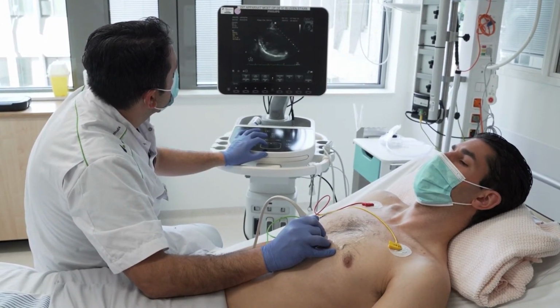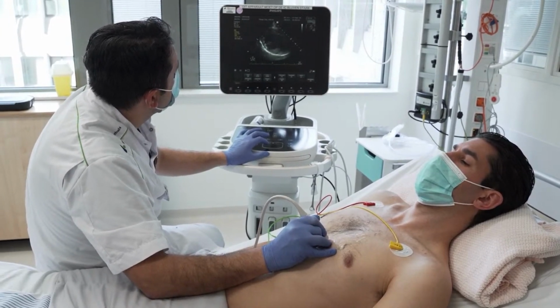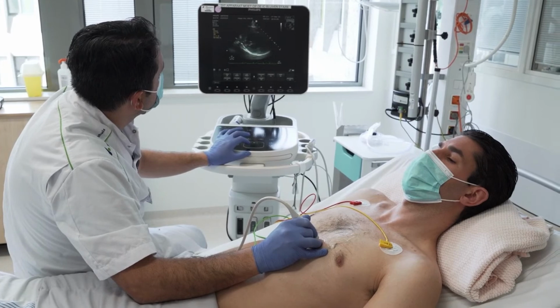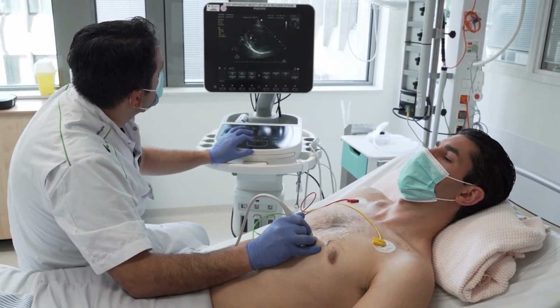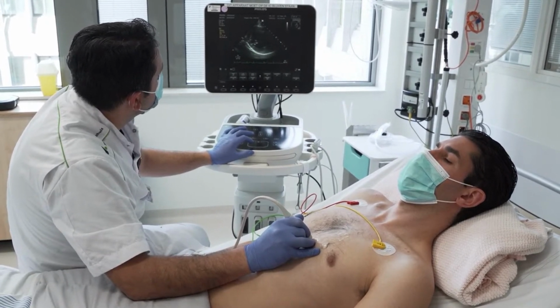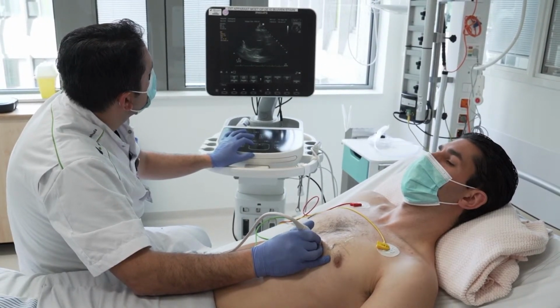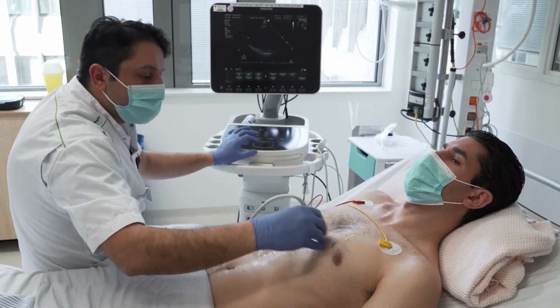Now we have a very beautiful short axis view with the mitral valve. As you can probably see, Sakir has gone down one or two parasternal spaces. So you really have to search for the best parasternal window. There can be great variability in that. So maybe we can now go to the third window, Sakir? Yeah.